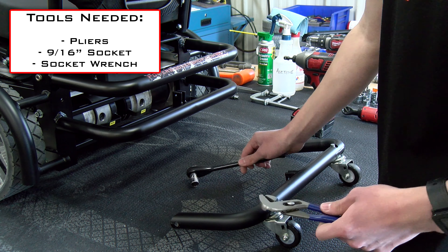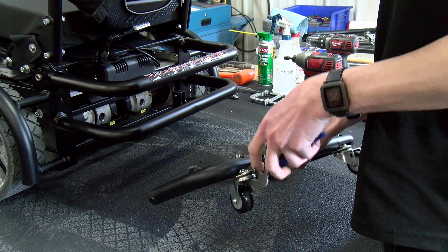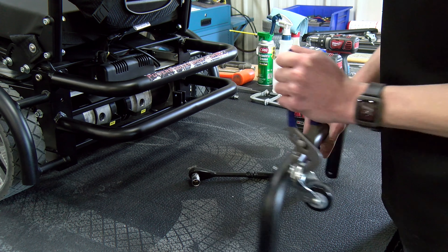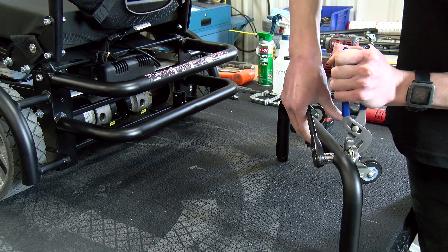We are going to be adding two washers to each rear caster. This should help prevent the chair from tipping back so far. Later on we will do a side-by-side comparison so you can see what it was in the beginning and what the end result is. It's not going to be a huge difference but it should be noticeable.